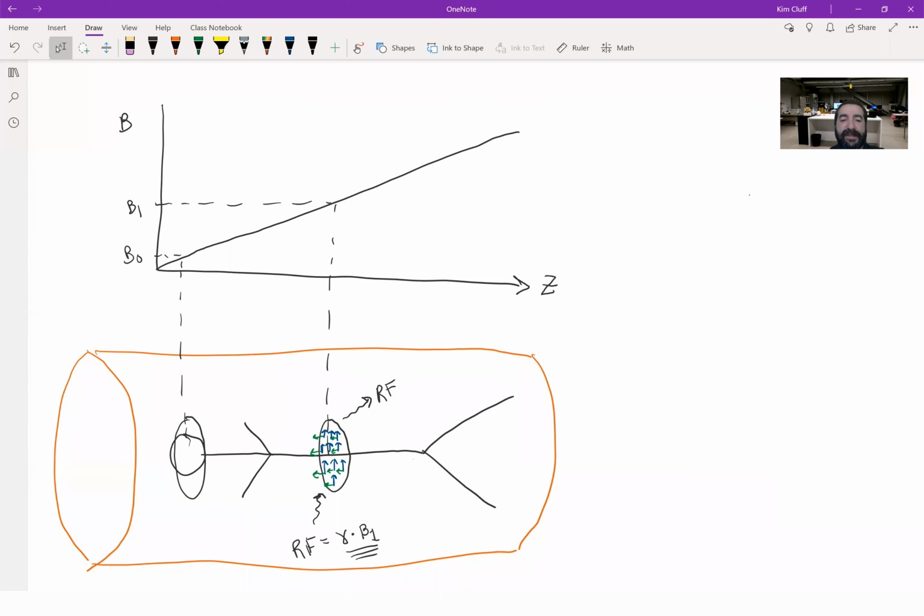Tremendous amount of energy. Gamma rays. In X-rays, again, you're working with ionizing radiation, which can damage the body. In this case, you're only working with magnetic fields, which, to our knowledge up till now, don't hurt the body. Okay, it just momentarily rearranges the magnetic moment of our hydrogen atoms.